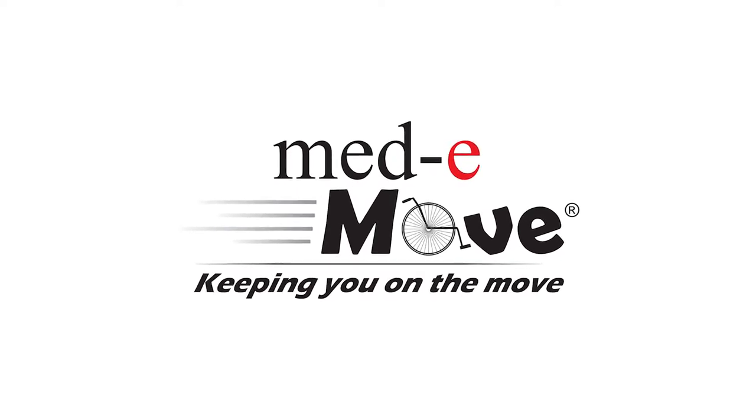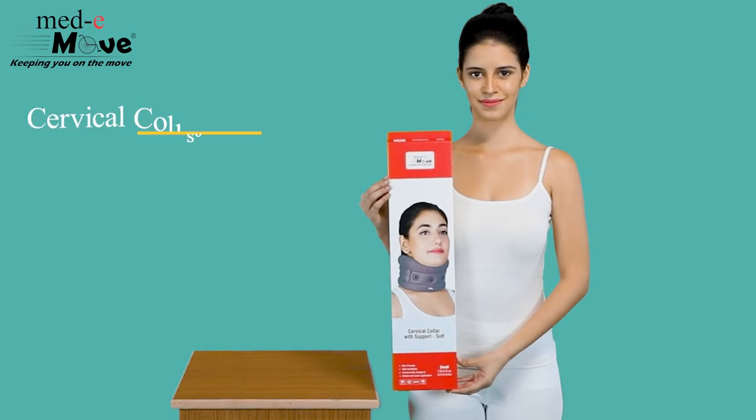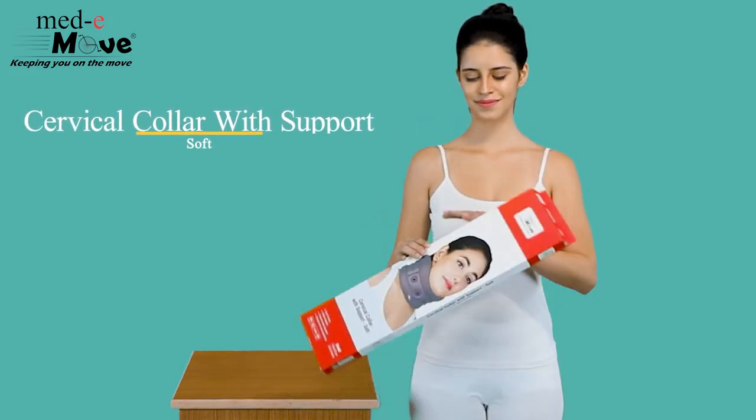Medimove. Keeping you on the move. Here we will demonstrate how to measure the size and wear the Medimove soft collar with support.